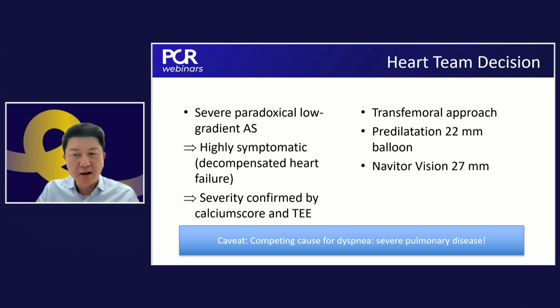Perhaps you can shortly highlight why it's so important in these patients, not only because of their rather small anatomy, but also the other factors that would speak towards a good hemodynamic valve. That's a very good point. We frequently struggle in daily clinical practice with which valve to choose, and it has really become an art to choose the best of the different platforms available.